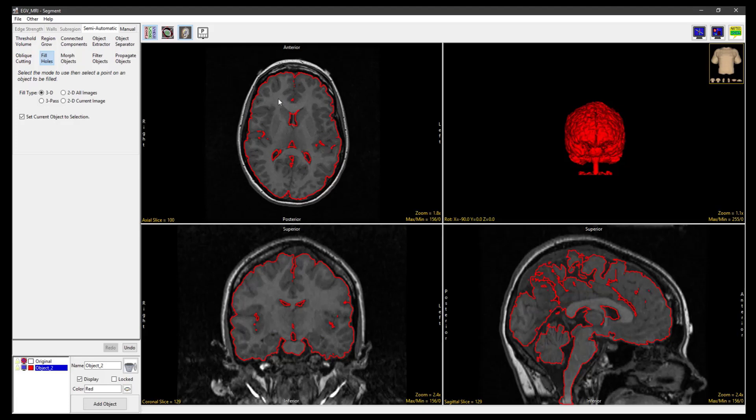To fill larger holes, such as the Ventricular CSF, use the 3-Pass Fill Type and click on the Brain. All larger holes will be filled and assigned to the object.